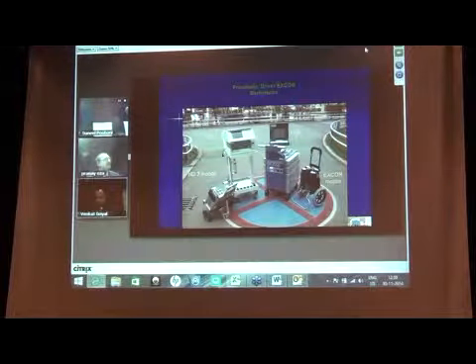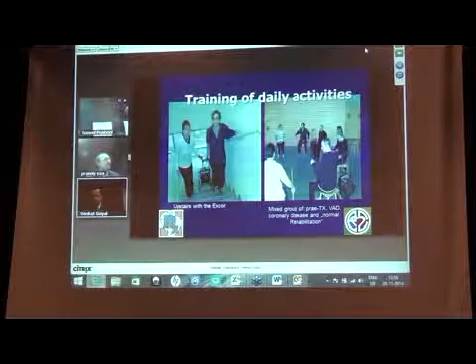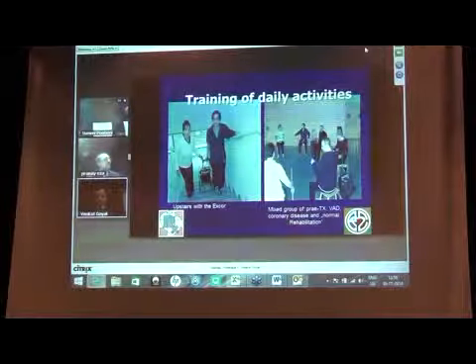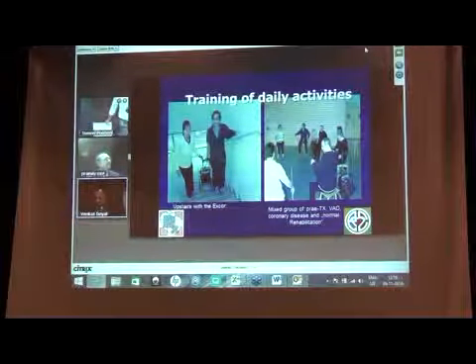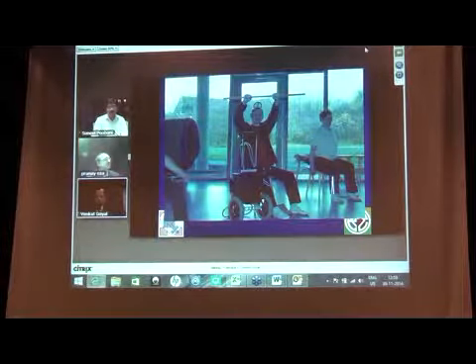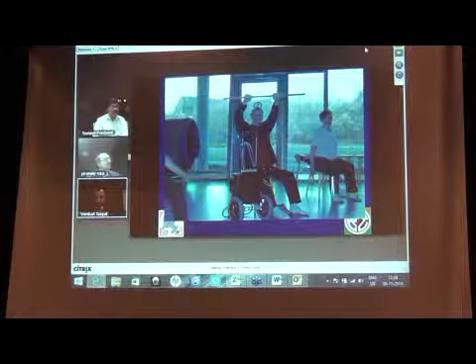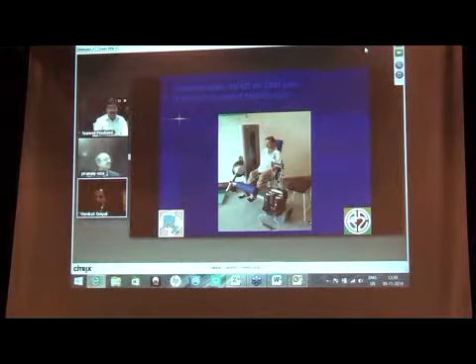This is how the patient would move around. At least the patient is mobile and carries himself with a pneumatic chamber, carrying a briefcase all the time. This is a gathering of all such patients during physiotherapy. They have become more ambulatory. They are outside the ICU. They are still in hospital, but at least outside in the hospital premises. And then the patients are exercising. They are alive with this system, which has become more compact, like the size of your laptop bag. Now they are outside the hospital, but still stuck to all these things.